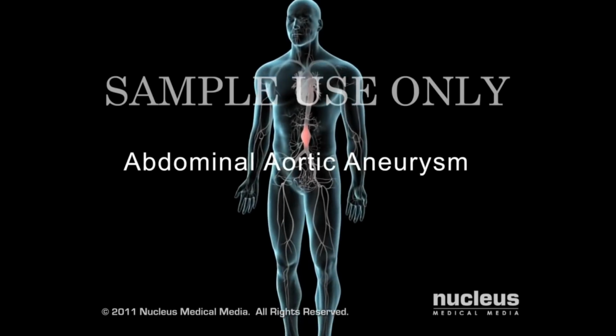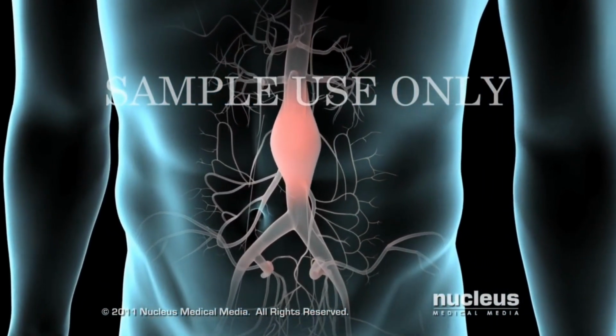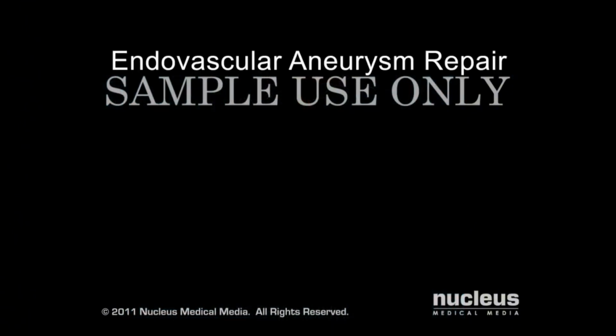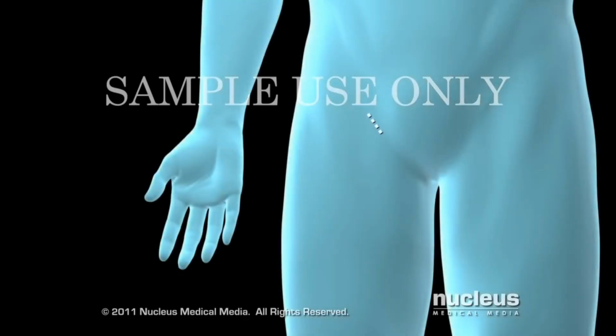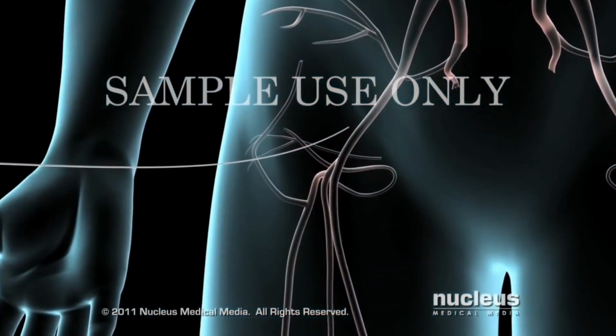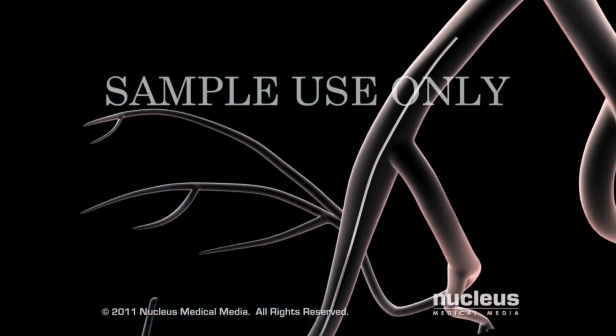Your surgeon will perform an abdominal aortic aneurysm repair to prevent the rupture of a bulging area of your aorta. Endovascular aneurysm repair. Your surgeon will begin by making a small incision in your groin over your femoral artery. Then he or she will insert a guide wire into the artery and gently push it up toward the site of your aneurysm.